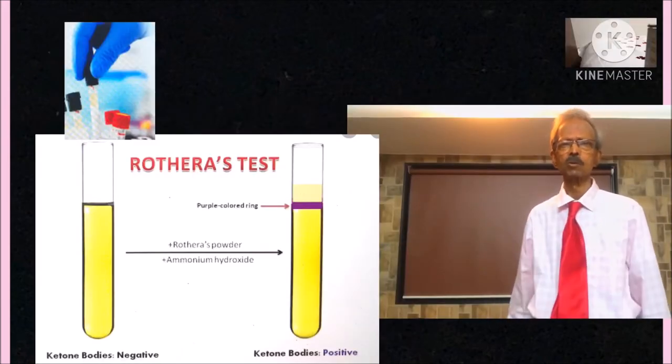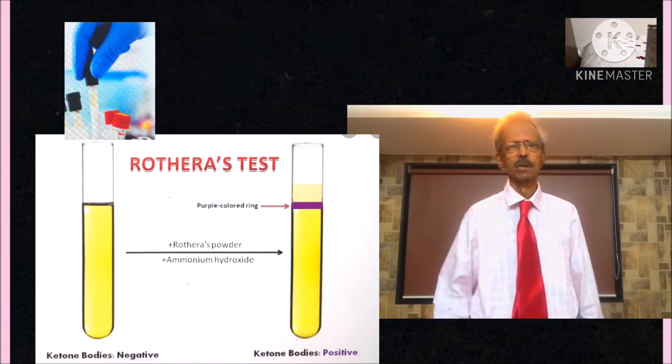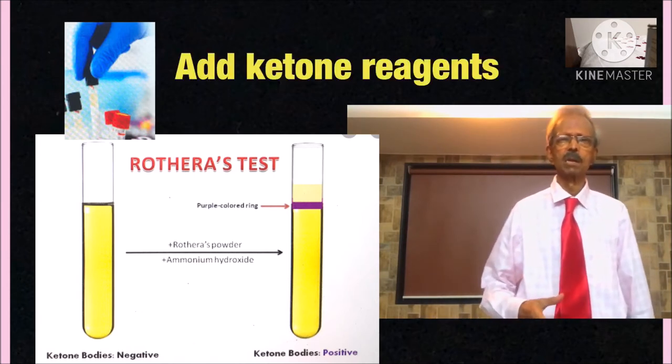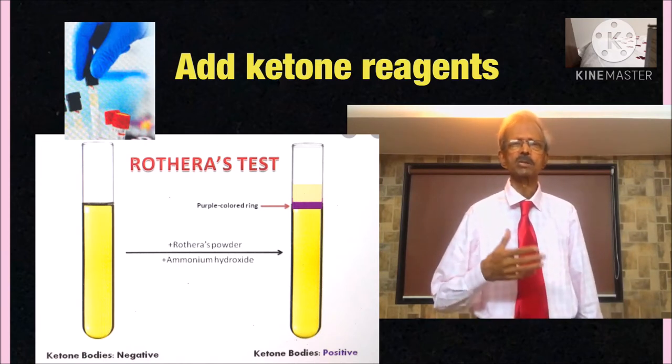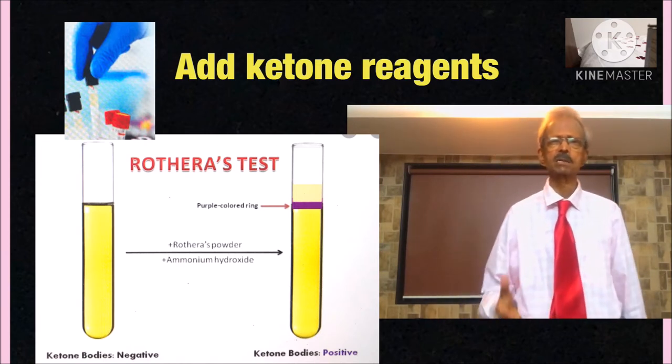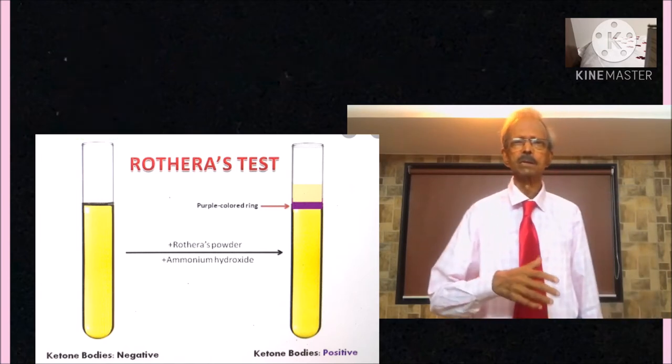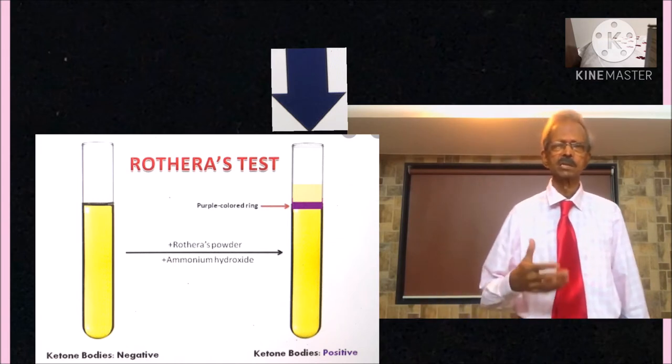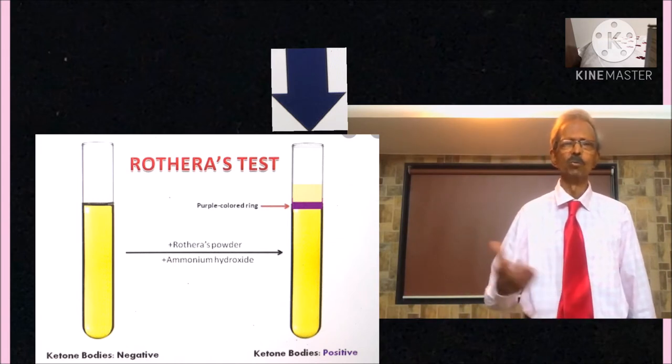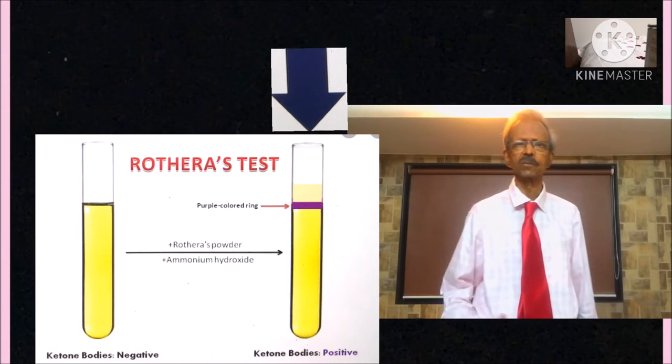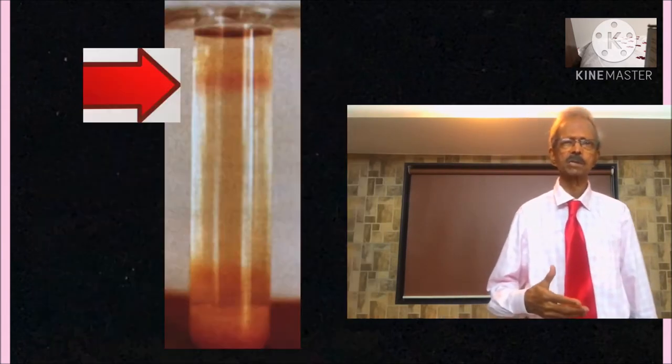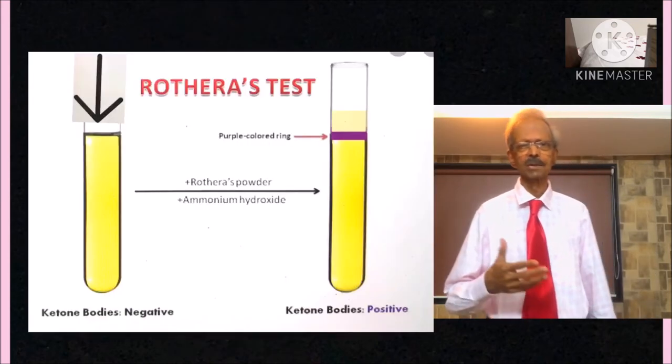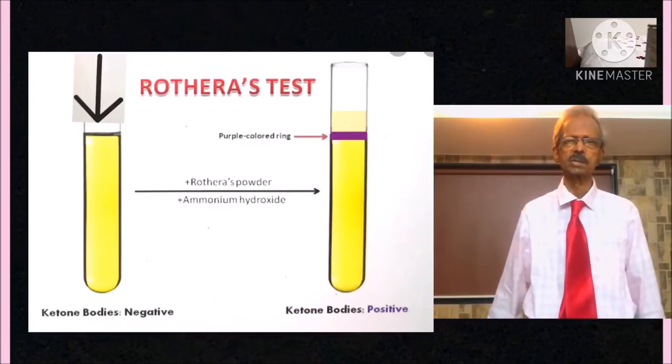For urine ketone body test, transfer urine in a test tube and add ketone body test mixture. Mix and then gently add ammonium hydroxide reagent from the test tube sides. If ketone bodies are present, then acetone from it reacts with sodium nitroprusside from the test mixture. And presence of purple ring at the top indicates test is positive for ketone bodies. No appearance of purple ring means ketone body test is negative.